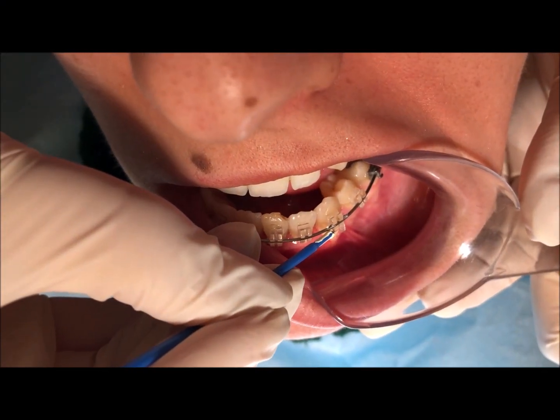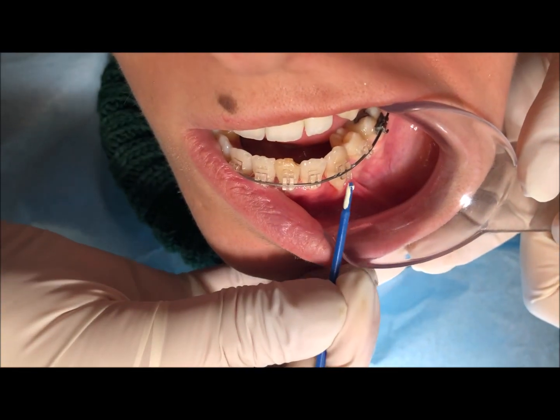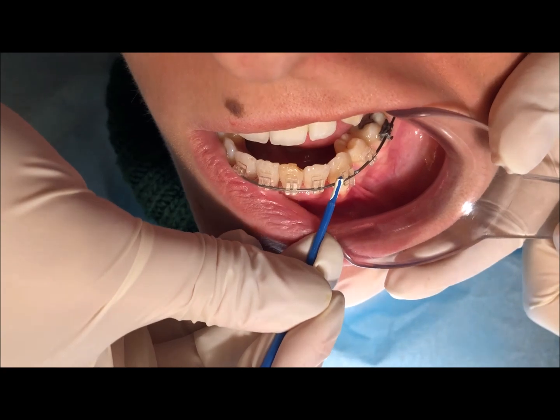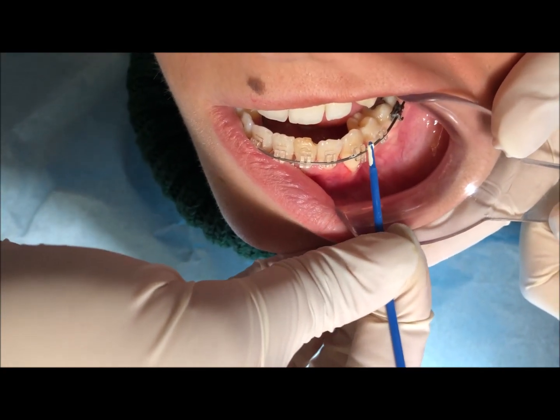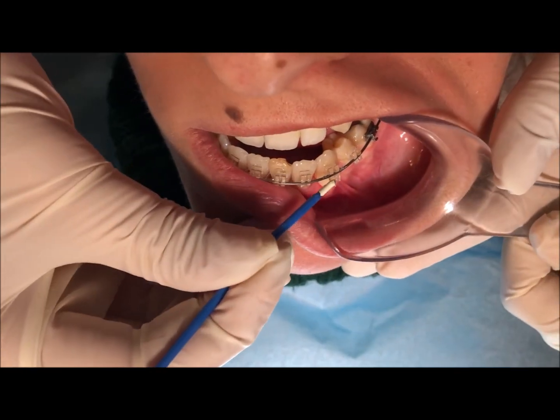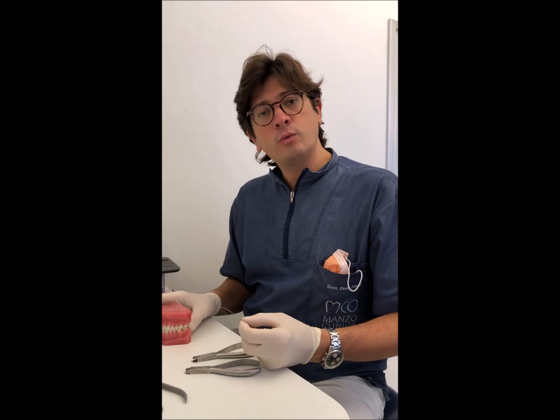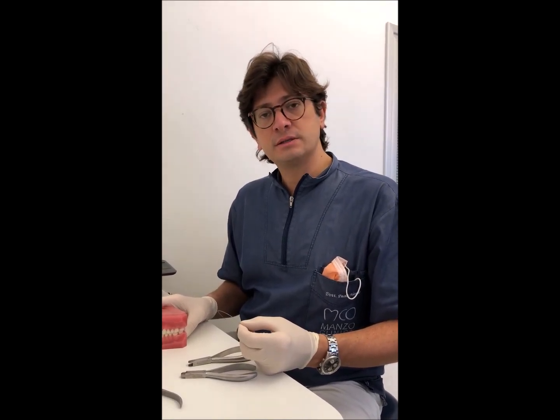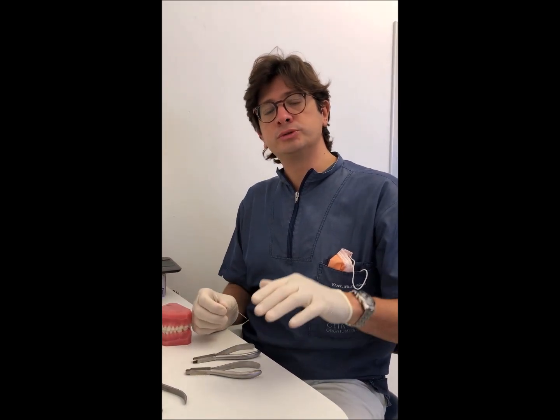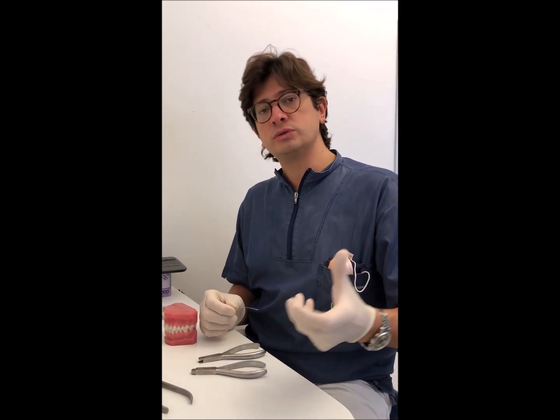We have to provide positive torque on tooth 33. We need to mark the position of the wire exactly close to the mesial and distal point of the bracket in order to provide torque activation only on that part of the wire going inside the bracket. We are marking the wire now. We want to provide to tooth 33, the lower left canine, some positive torque in order to put the root lingually and to increase the embedding of the root inside the bone.